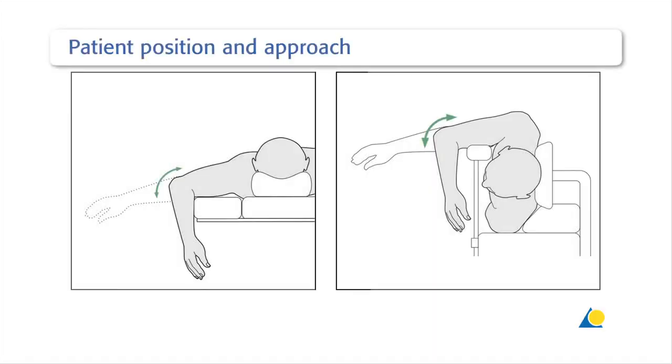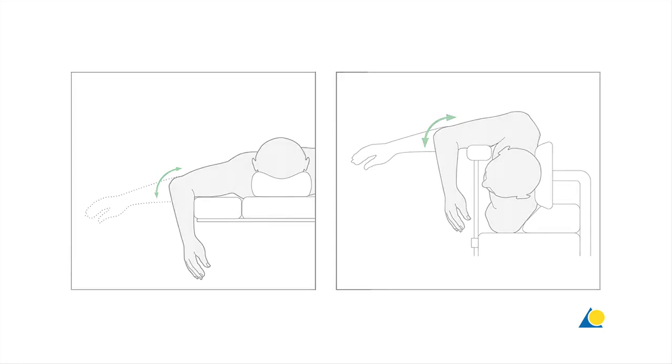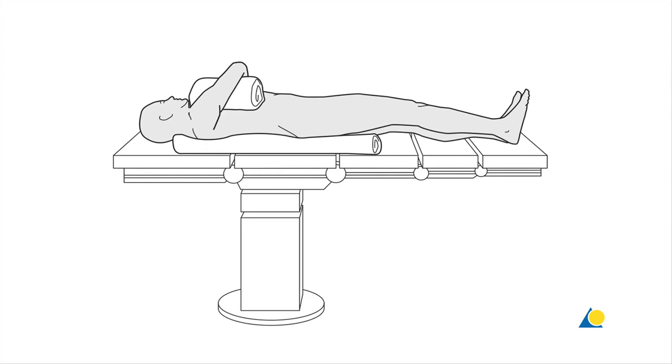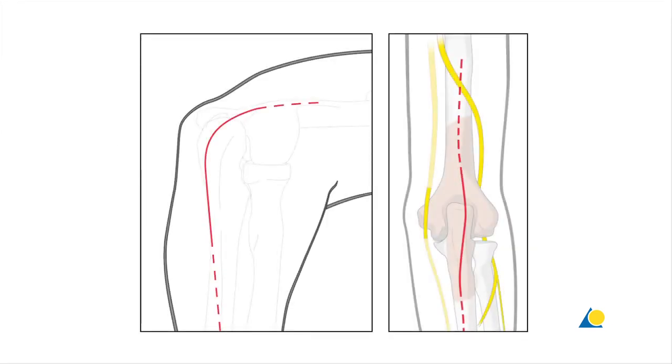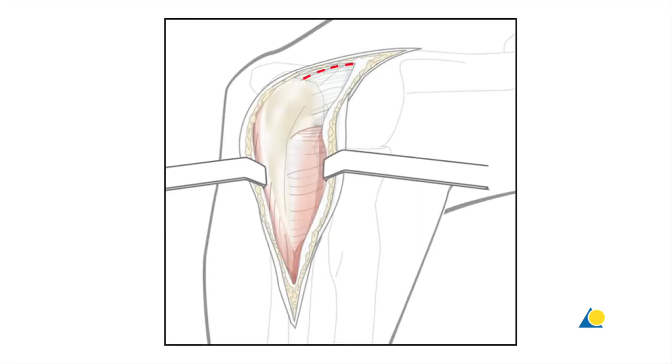The patient is positioned prone or in lateral decubitus position with the arm on a radiolucent support. The use of a tourniquet is optional. A supine position is also possible, although in this position there is less access for the image intensifier. The incision is started 3 cm proximal from the tip of the Olecranon and curves slightly radially around it, and extends distally 4 to 5 cm. The triceps tendon is identified and split longitudinally down to the Olecranon, and proximally down to the joint surface.